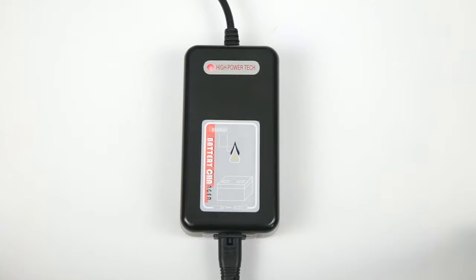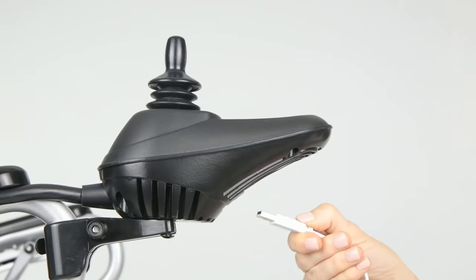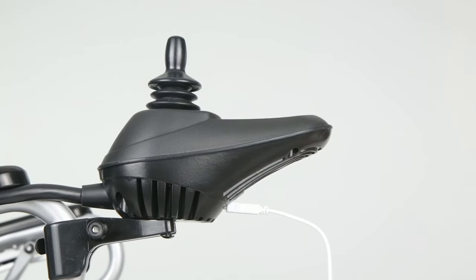the charging indicator will illuminate green. To charge small electronics off of the wheelchair battery, simply connect your USB to the underside of the controller. Please keep in mind that this does not charge the wheelchair battery itself.